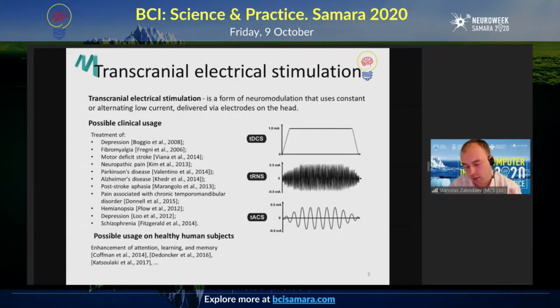You could use our bands, alpha, beta, gamma, theta, delta ones, and there's a separate study devoted to AC stimulation in the alpha range of 10 hertz and how the stimulation in this band would impact certain brain functions.